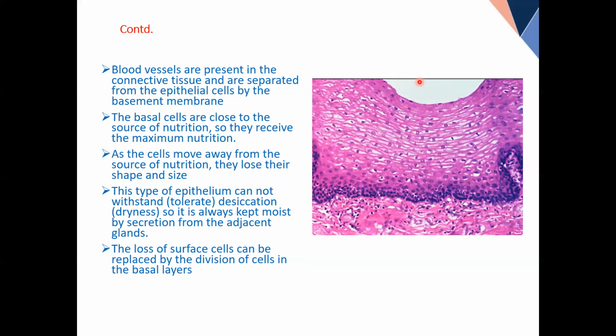Yes or no? So what type of epithelium is required in the oral cavity? Simple or stratified? The moist one or the dry one? So here we have stratified squamous epithelium without keratin. So stratified squamous epithelium can be with keratin or without keratin.